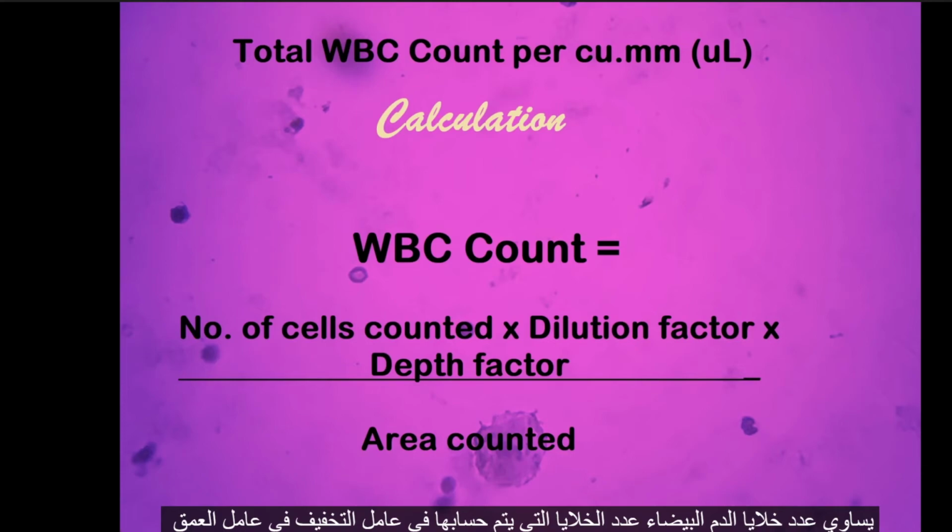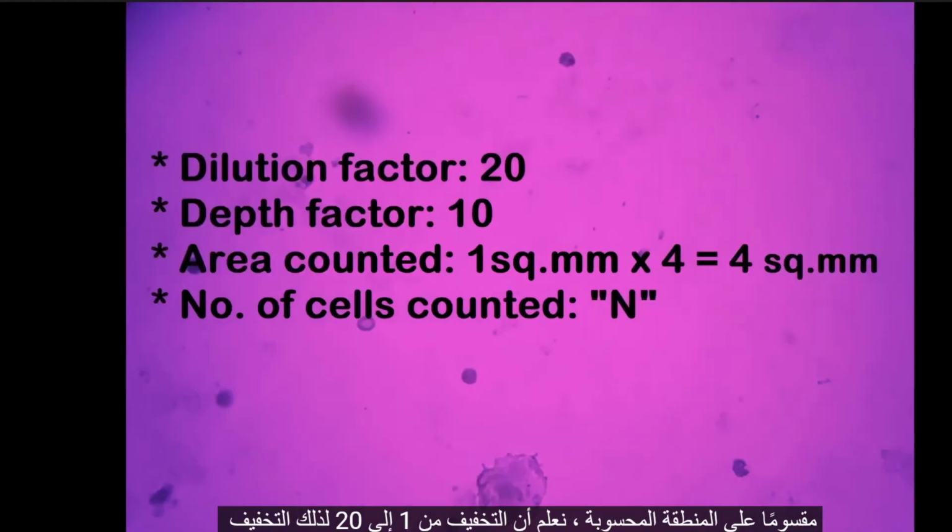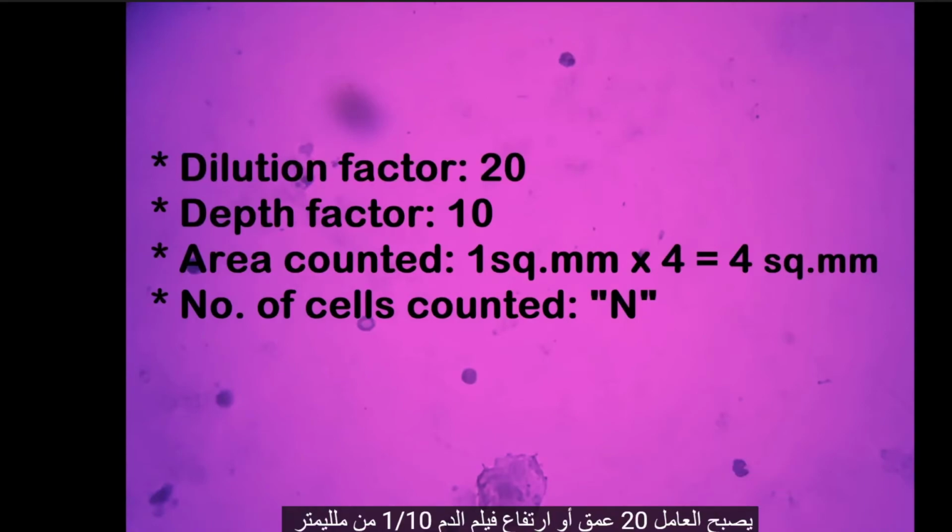WBC count equals number of cells counted × dilution factor × depth factor divided by area counted. We know that dilution is 1:20, so dilution factor becomes 20. Depth or height of the blood film is 1/10 of a millimeter, therefore depth factor is 10. Area counted is 1 square millimeter times 4 squares, which equals 4 square millimeters.